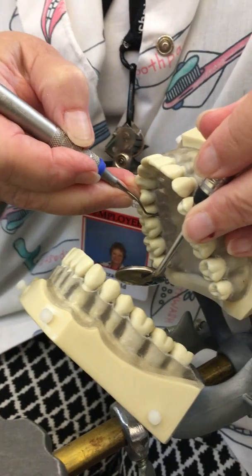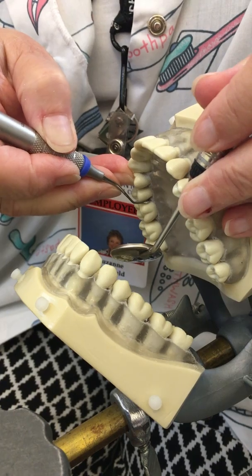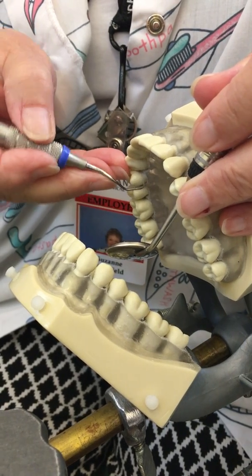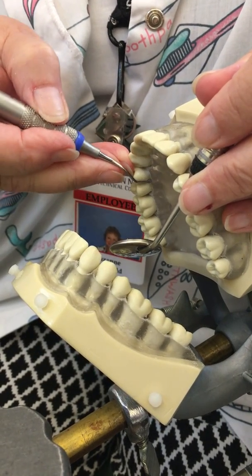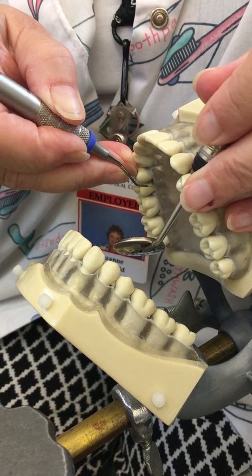Closed, open. Remember closed is pulling the shank toward the tooth surface that you're on, and open is pulling it away from — but not off.